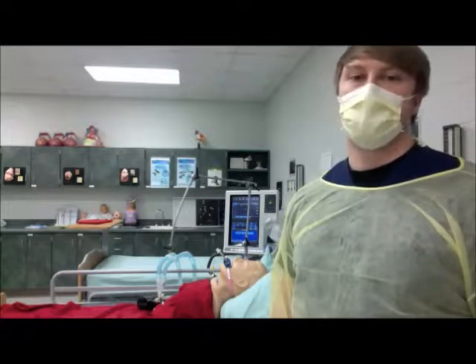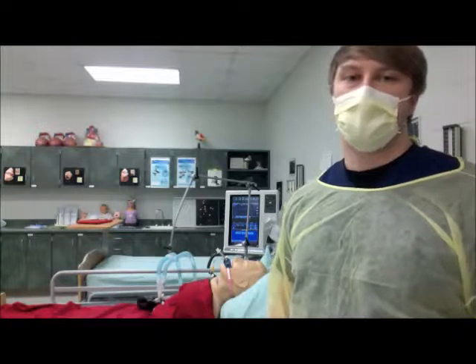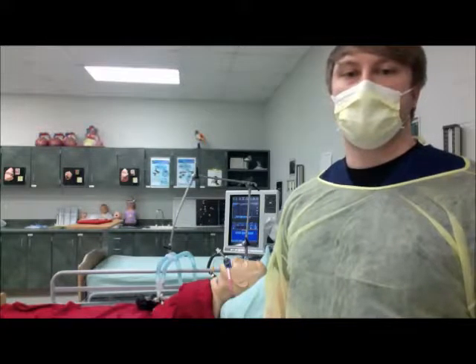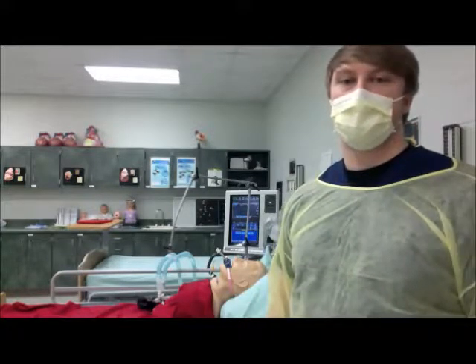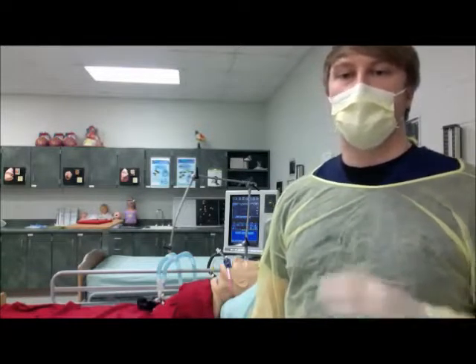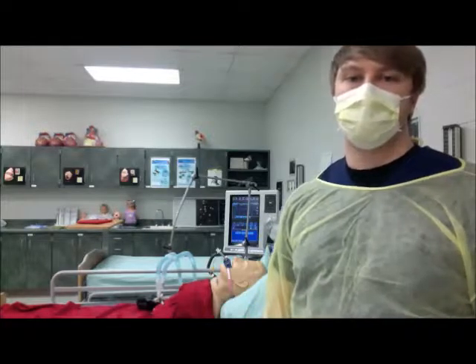Fast forward 1 hour, and now we're going to obtain her weaning parameters. The first weaning parameter I'm going to obtain is a spontaneous tidal volume. So what is a spontaneous tidal volume? Well, a normal tidal volume is just a normal breath in and out. Spontaneous tidal volume is whatever the patient's spontaneous breath in and out. The normal is between 6 to 8 mLs per kilogram.